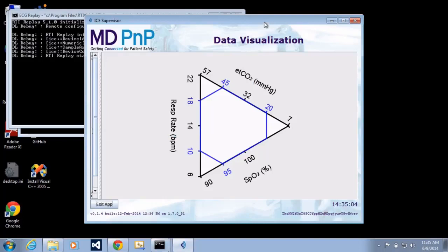So that's running, and shortly you'll actually be able to see as this discovers the pre-recorded device data, and it's going to start displaying ranges of values here inside the data visualization UI. There you can see that the data's arrived. You can see here in this display the respiratory rate and also the pulse oximeter oxygen saturation values. And you may have noticed, but in our example, the pulse oximeter values are actually updating over time.